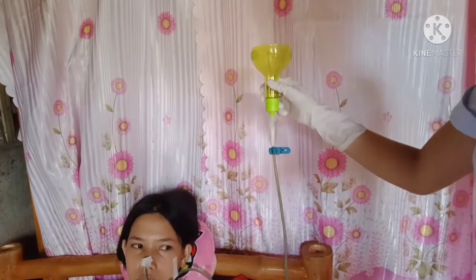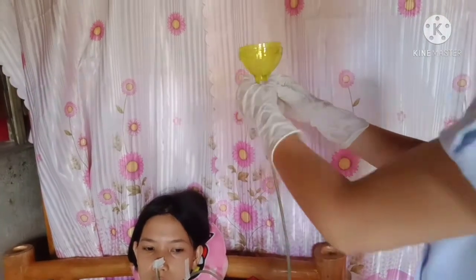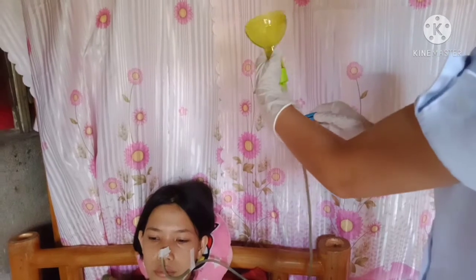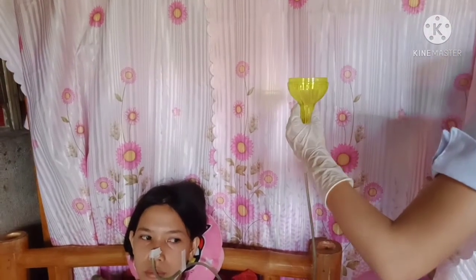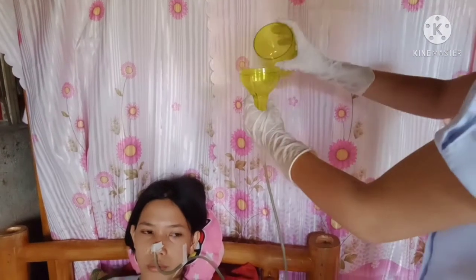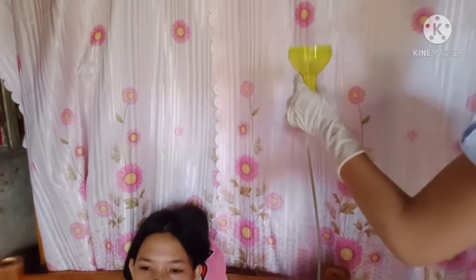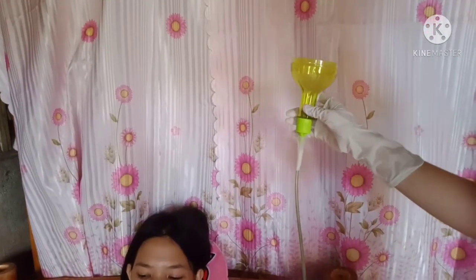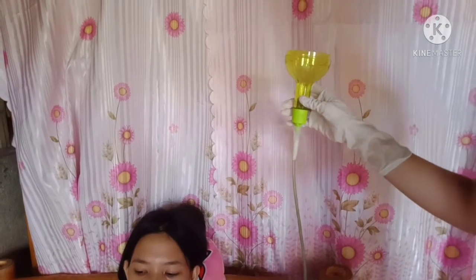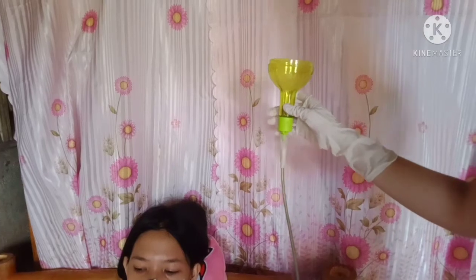So after that, we have to administer water via the feeding tube as ordered with diluted formula. Unclamp the tube and then administer water. This provides the client with a source of water to help maintain body fluid and electrolyte balance.